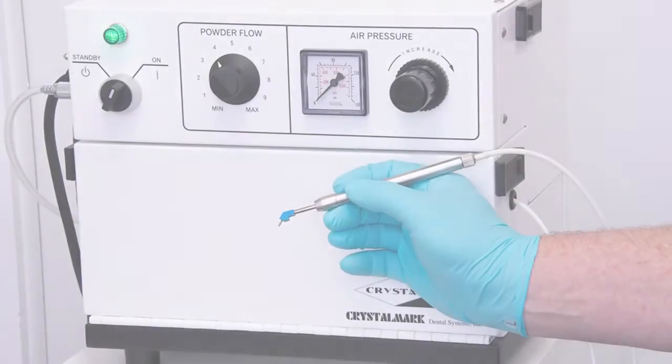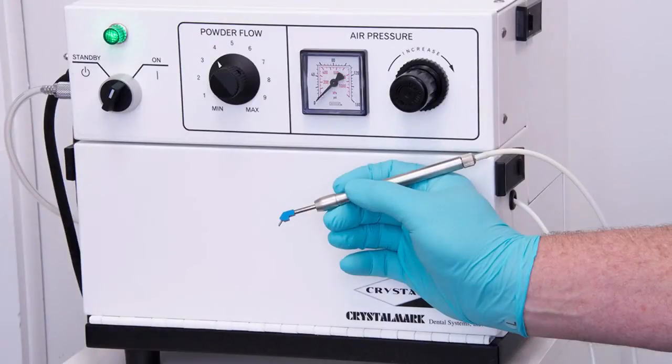Micro air abrasion is a new tool that I have been using for about a year and a half. The Crystal Mark unit is one of the most useful tools that I now have in my practice.